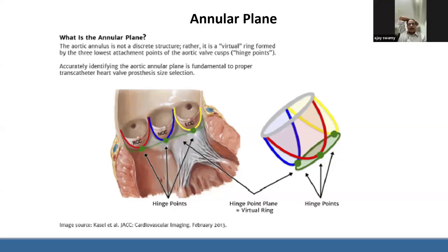But so much I learned about simple things like positioning the patient and ECG gating and non-gating. We just say ECG gating protocol and send them off to the radiologist, and then we try and make whatever we get out of those images, and we keep thinking that we've done a great job. But I think it was a great learning experience on actually how to acquire the images. That is great learning because we don't really look at that part very carefully.